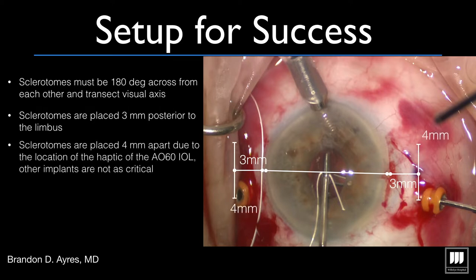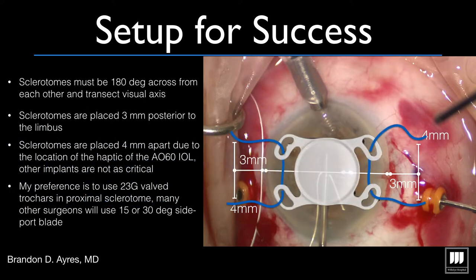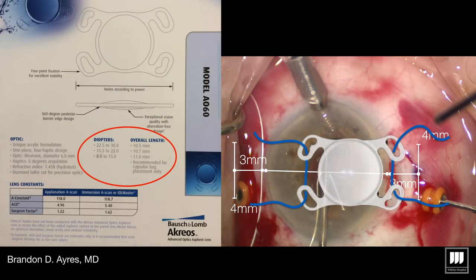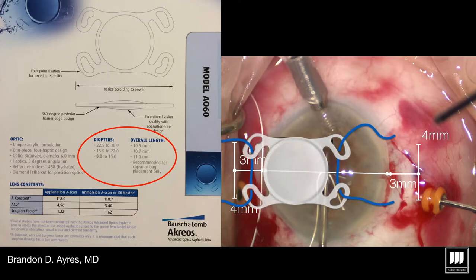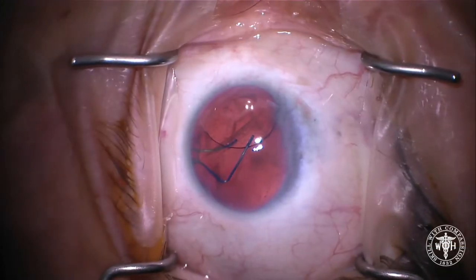We're now measuring 3 millimeters back and 4 millimeters apart. Especially in the case of the hydrophilic acrylic IOL, the AO60, that 4 millimeters apart is going to correspond to where the haptics are on that IOL. The AO60 implant does not reach sulcus to sulcus, so it's important to balance suture tension to center the lens.